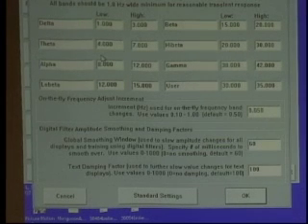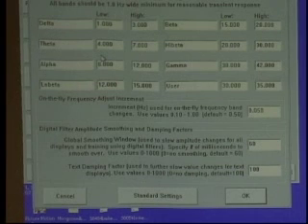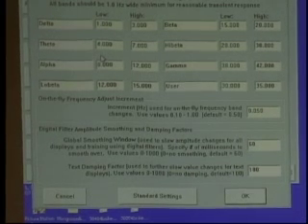You can widen the filters. I've seen people do a wide inhibit where they'll do a wide low inhibit from 1 hertz to 13, and then a high wide inhibit from 20 to 40 or something. It's fully adjustable. And I've seen people do multiple inhibits where they inhibit eight different inhibit bands and they're each one or two hertz wide. So you have full flexibility any way you want.